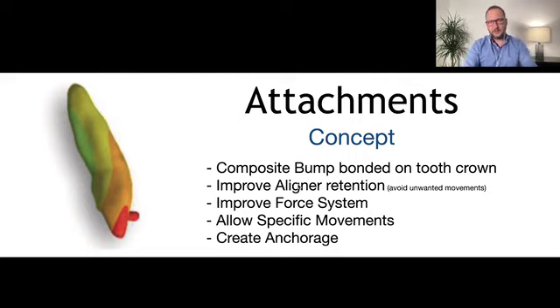Okay, because what we are creating in the software, and this course is not going to talk specifically about one software, although I'm going to use Invisalign as a reference for my cases. I don't have any exclusivity with them. I want to always make this clear, okay? And what we want to do is create force systems, and the attachments are very important for this. Attachments can allow us to do specific movements.